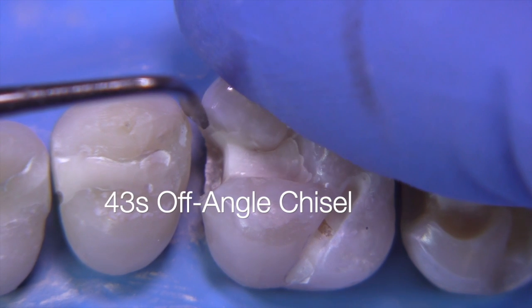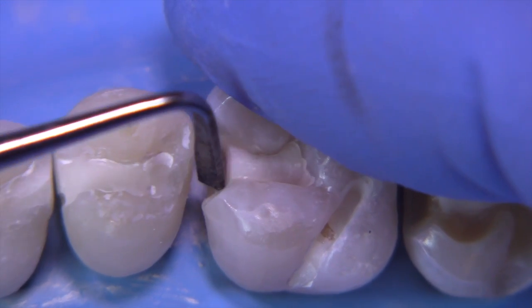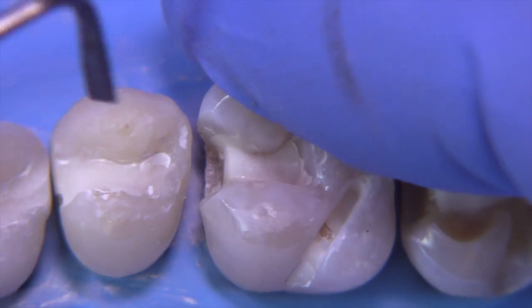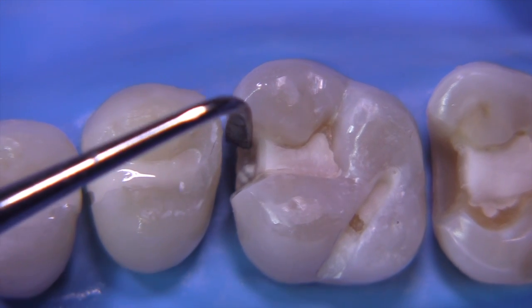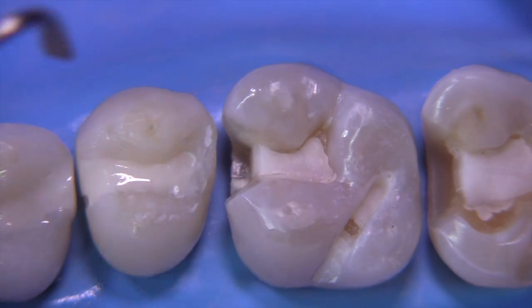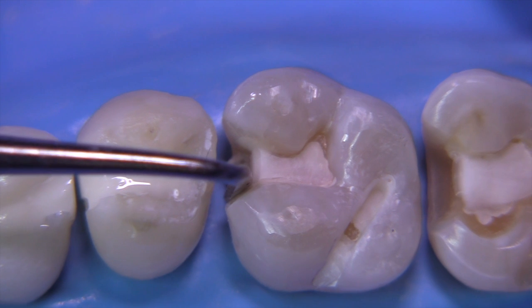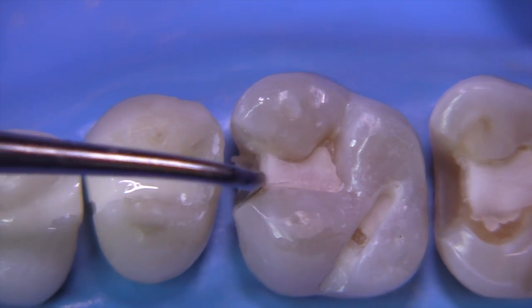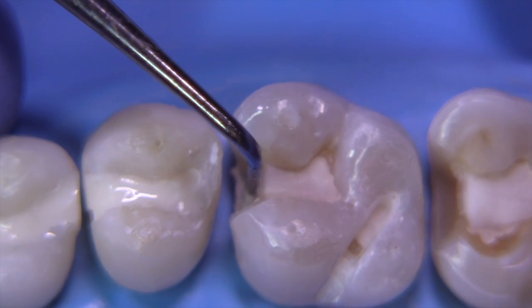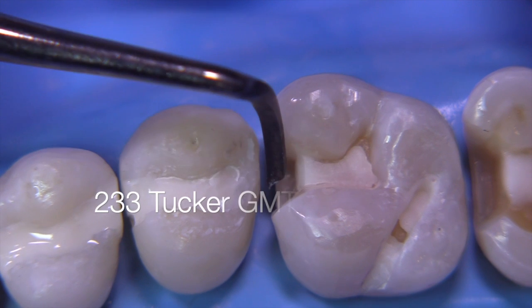Now we're using the 43 off-angle chisel — this is used for the mesial; the 42 off-angle chisel is used for the distal. We're chopping the instrument down along the wall, focusing on the line angle, and then sliding it over the gingival. So if you chop down one way and then slide back, you'll make a nice line angle. Turn the instrument around and perform the same maneuver to refine the internal line angles. Slide down the wall focusing on the internal, and you can slide it three different directions to get the point angle. Don't forget to go down the axial wall, as it may have had a few little scratches from using the off-angle chisel on the proximal walls.